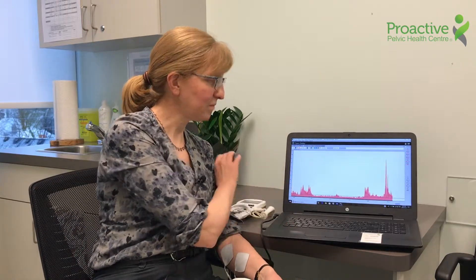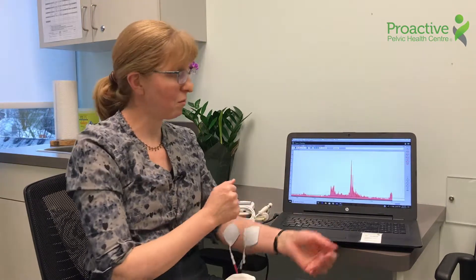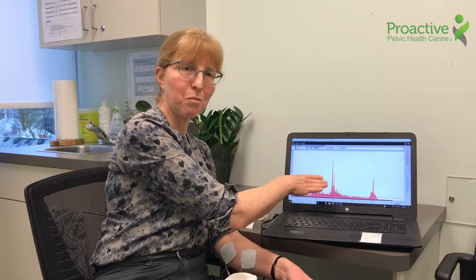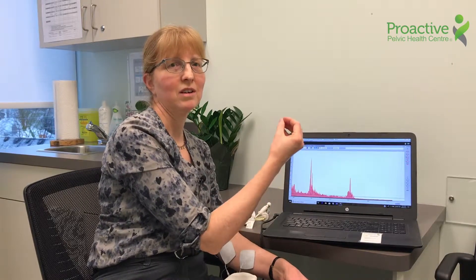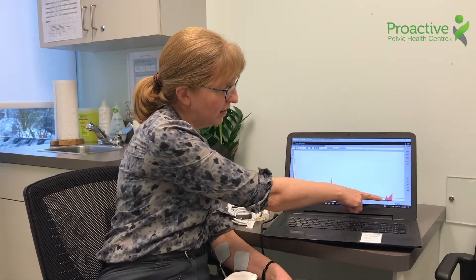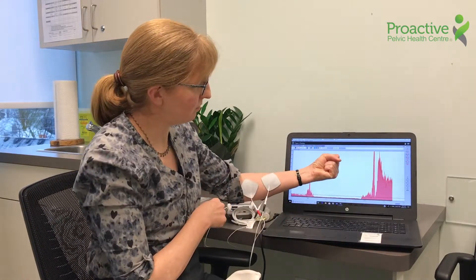This is the biofeedback tool and it measures things and shows my muscle contractions. I've just got them on my forearm for today, but the muscle contractions you can see on the screen — and this is the really helpful bit. People say, oh now I understand, when I've got that contraction I can see it happening on the screen. My forearm muscles are pretty quiet right now, and then if I make a fist you can see how that shows on the screen.